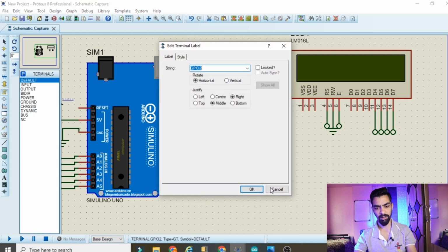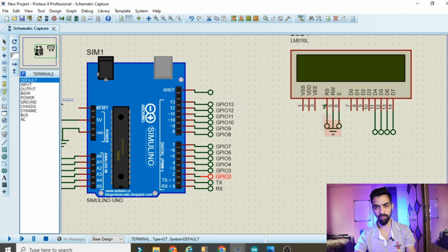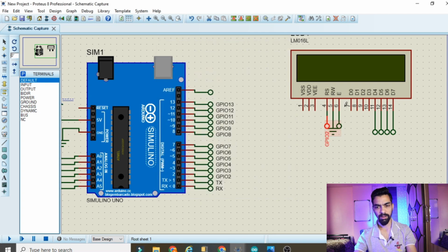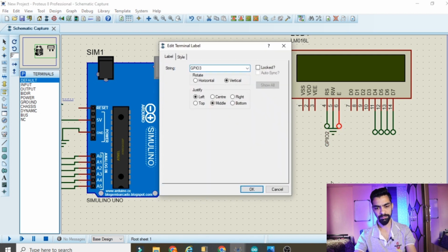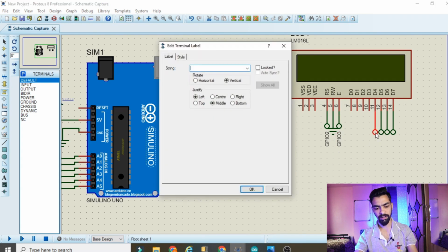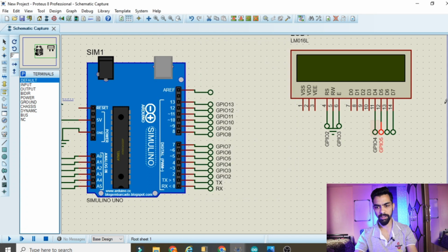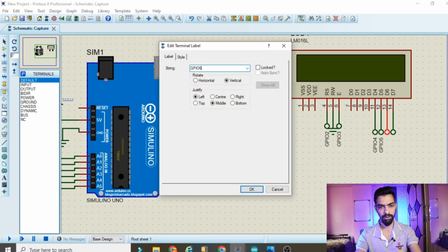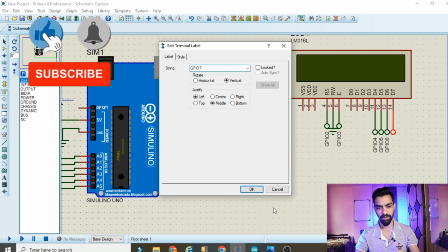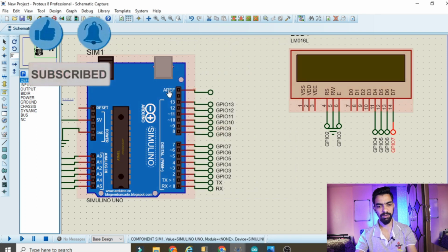Then the RS pin should be connected to GPIO2. So double click on this RS pin and give your name GPIO2. Click on OK. Then the enable pin should be connected to GPIO3. So double click here and give your name GPIO3. Click on OK. Then D4 should be connected to GPIO4. So double click here and give your name GPIO4. Click OK. Then double click here and give your name GPIO5. D5 should be connected to GPIO5. Then D6 should be connected to GPIO6 and D7 should be connected to GPIO7 and click on OK. So in this way we complete the LCD with the Arduino connection.